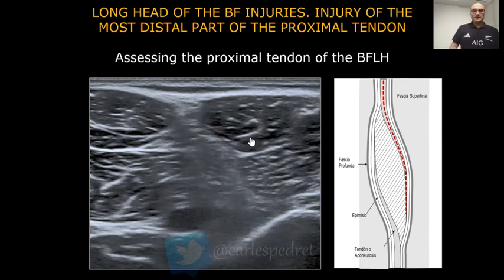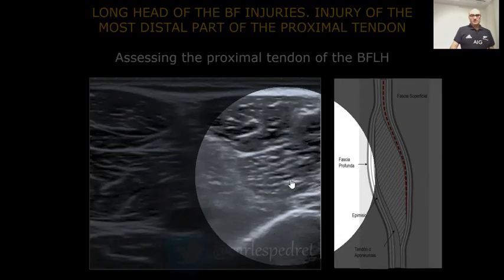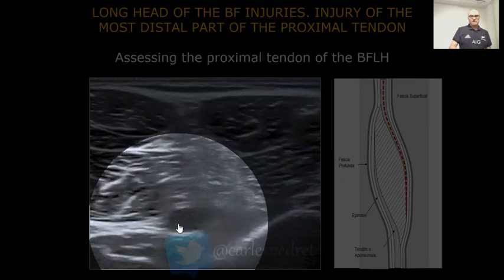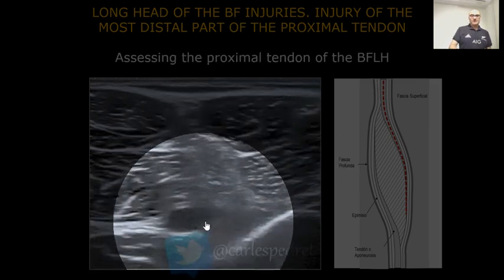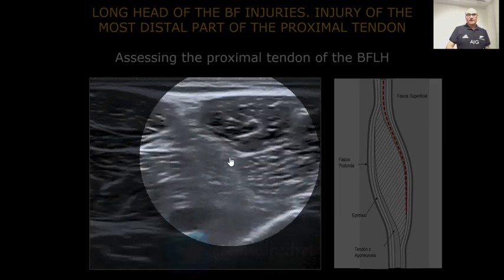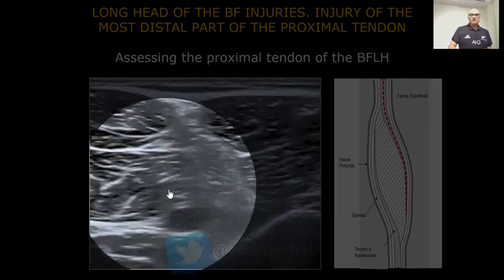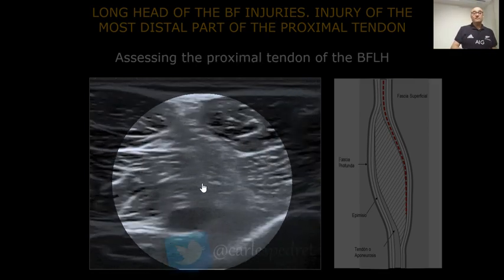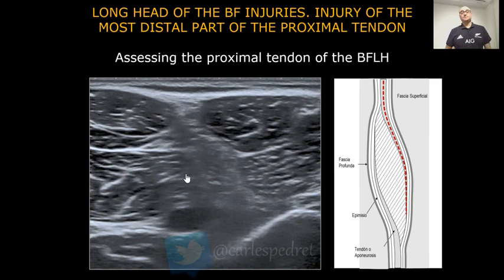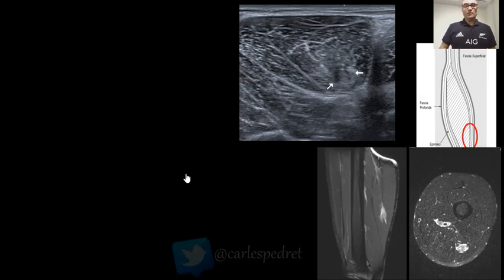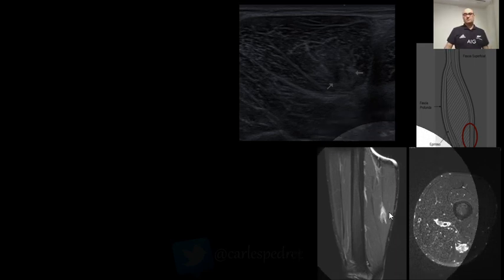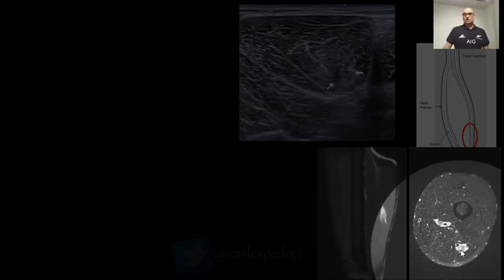Here we can see the short head of the biceps femoris and here the popliteal artery. So we are almost in the most posterior part of the knee — very, very distal. And here we can have an injury that looks like this in the MRI: a very small tip, a very small dot here.